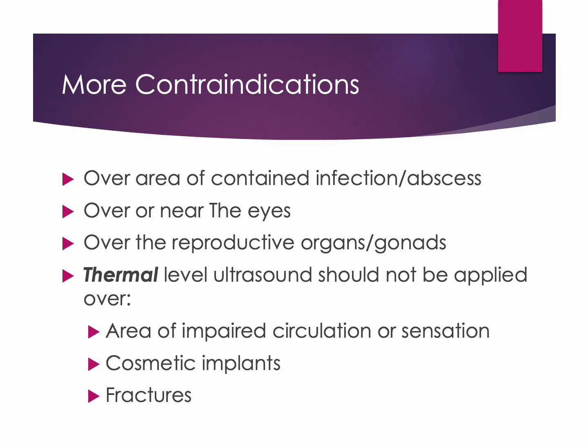Ultrasound should also never be applied over or near the eyes. Ocular tissues are highly sensitive to mechanical and thermal energy, and the lens and retina are particularly vulnerable to damage from overheating. Even relatively low levels of ultrasound energy may increase the risk of cataract formation or retinal injury. Another contraindication is applying thermal ultrasound over the reproductive organs or gonads. The testes are particularly sensitive to heat, and excessive temperature increases may negatively affect sperm production and reproductive function. Because of these concerns, ultrasound is avoided directly over reproductive tissues.